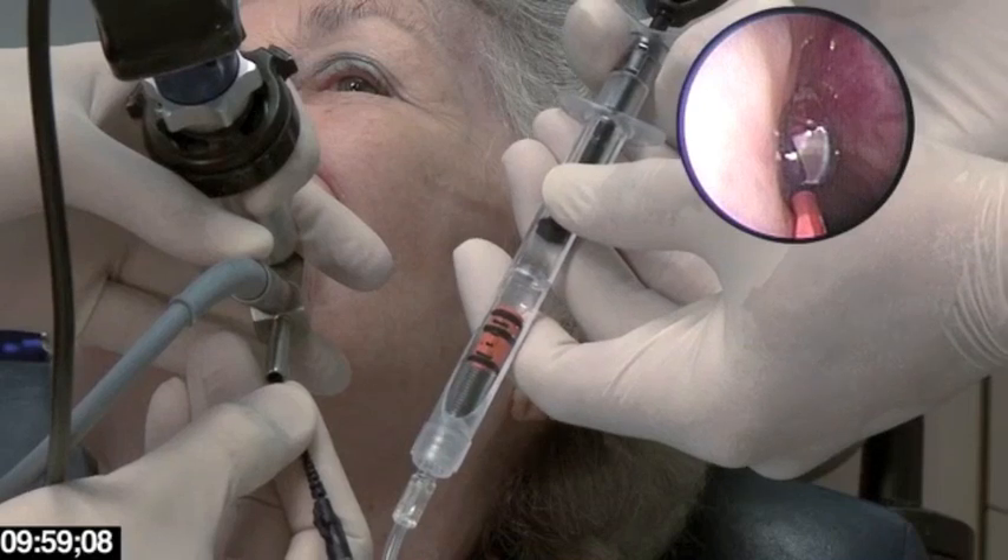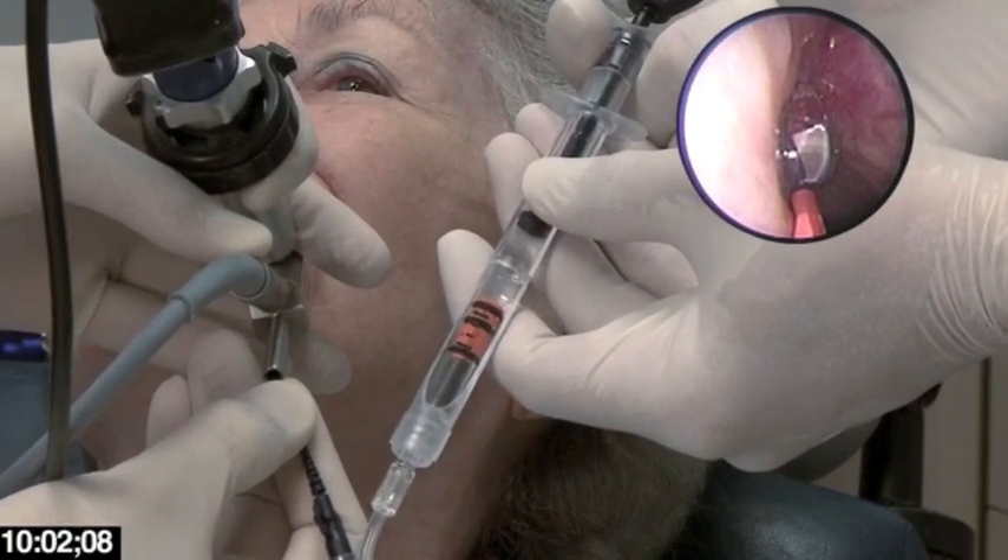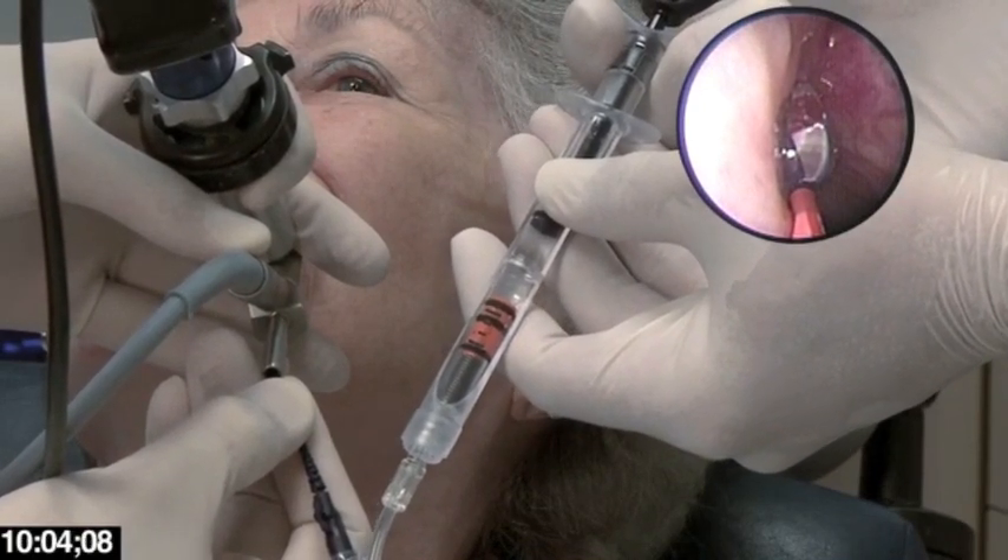I allow it to stay inflated for about five to six seconds or so, and then slowly deflate.